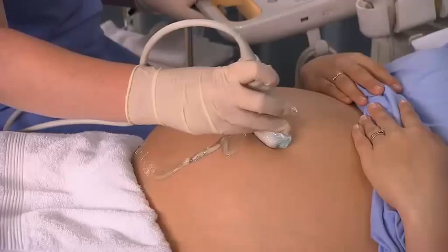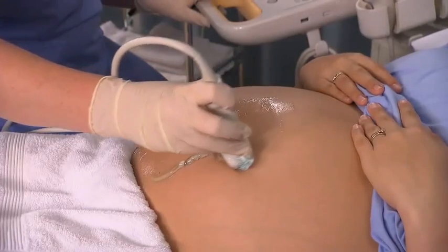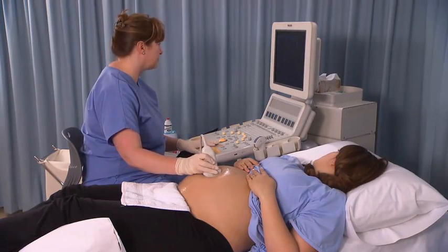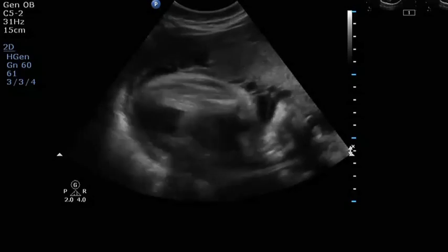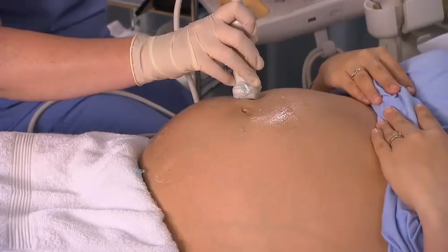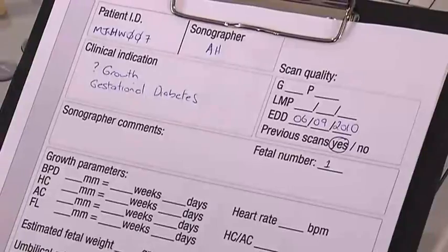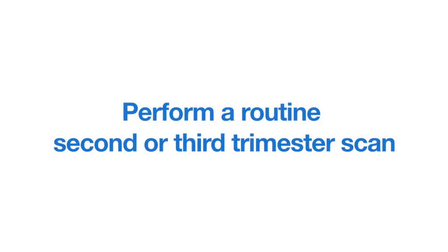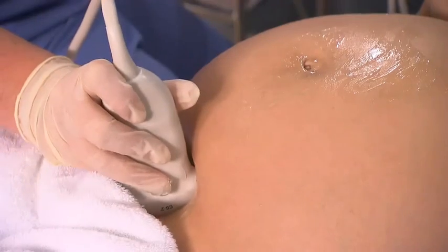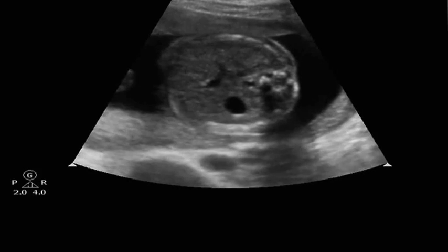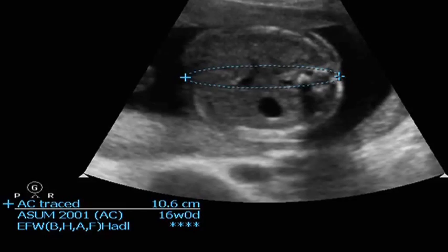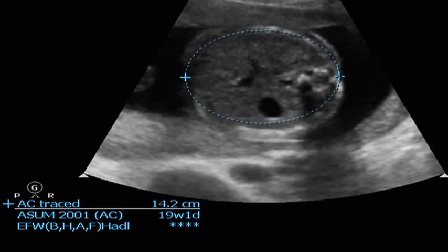Perform a survey of the maternal pelvis and fetus using a suprapubic view. With the patient supine and her head elevated, a routine anatomic scan is performed, plus any targeted scans requested by the referring physician. Perform a routine second or third trimester scan. Annotate and measure the appropriate structures.